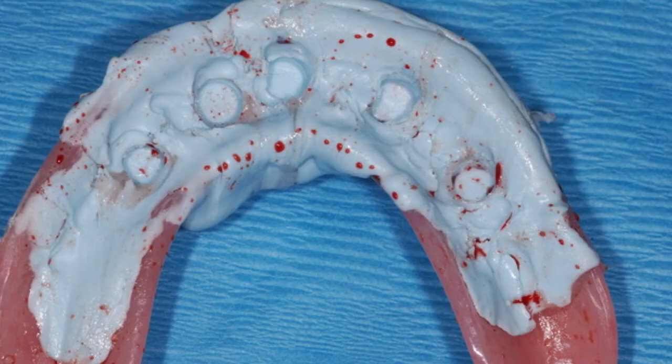And then we go back to our verification index when we start. So the lab makes us a verification jig, a thicker index that we put onto the upper teeth so it rests on the upper teeth. We'll take the lower denture and put that into the verification jig. We've got our blue mousse in our denture, and then we'll have the patient close their jaw into the denture, so we're always keeping our vertical consistent. So now we know where the abutments are.